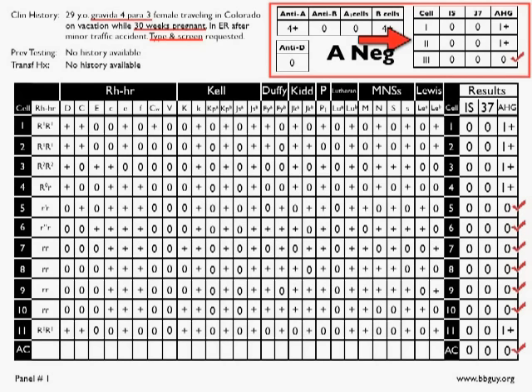And you see a 1+ reaction only at the anti-human globulin phase in cells 1 and 2. I should tell you, I'm giving away the panel a little bit, but when an immunohematologist on a 3-cell panel sees reactions in cells 1 and 2, they will almost always think first of an anti-D. And we'll see if that's the case. It isn't always anti-D, but it very commonly is. So that's the first thought that will come to an immunohematologist's mind. Okay, so we've worked through that.